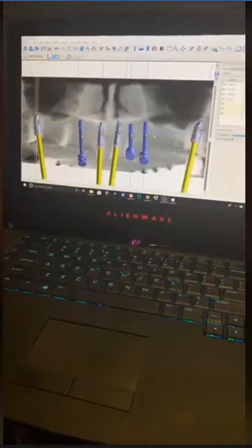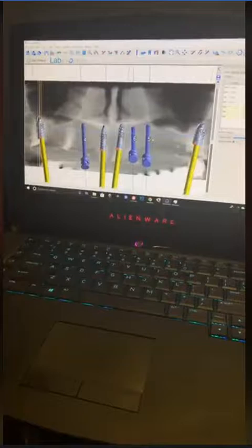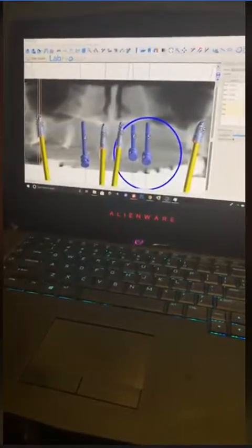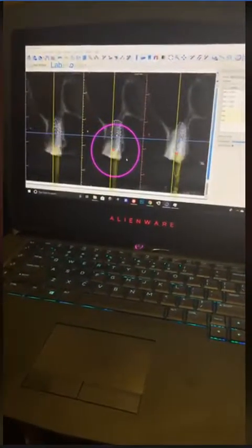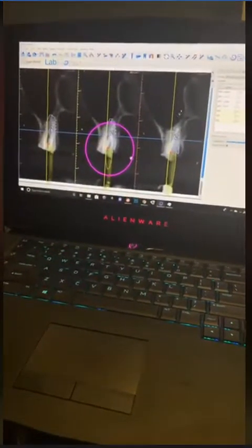So you place an implant in there, you're taking photographs, and what happens? At the end, the photograph shows up and you say, oh my gosh, what the heck happened here? All along the implant was in the lingual, I placed it, and now it's sitting at the incisal edge of the tooth. That's because even placing an implant becomes very, very difficult. So, in this particular case, I want to show you the cross-sectional on each one of them. Here is 2. Okay, this number 2 is 5 by 11.5.